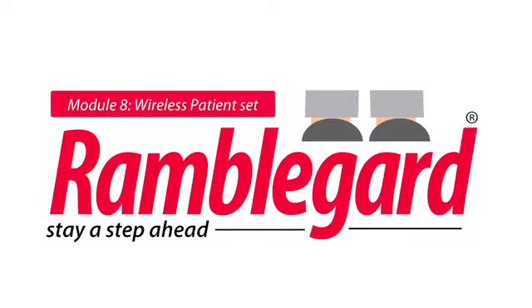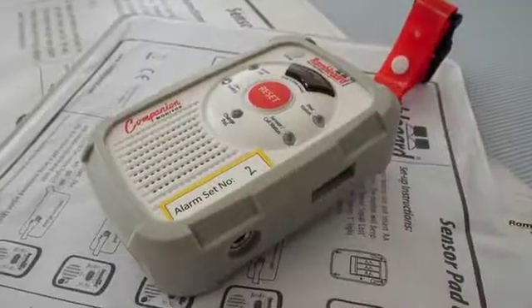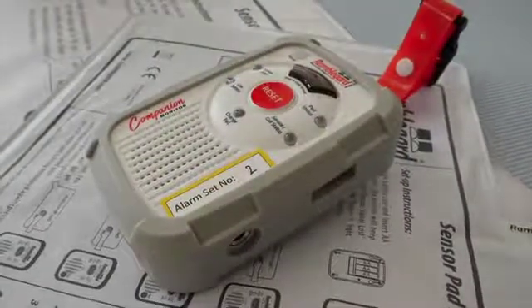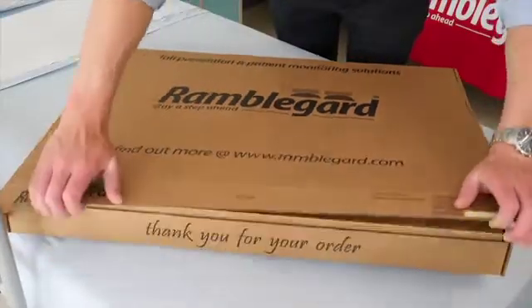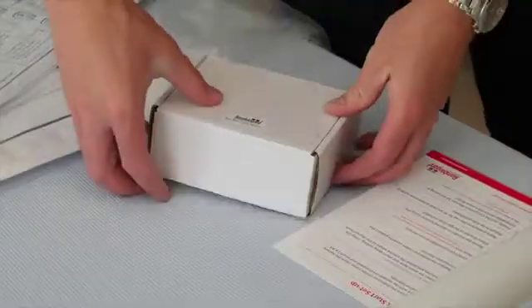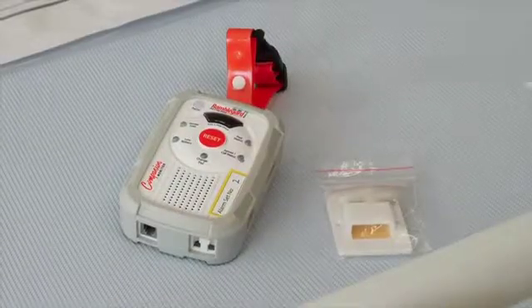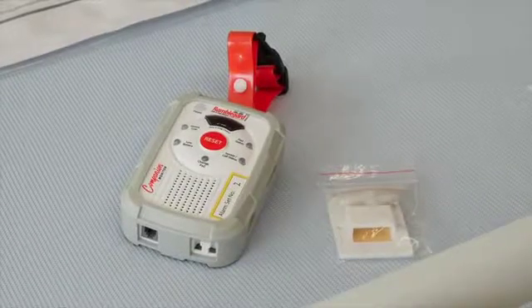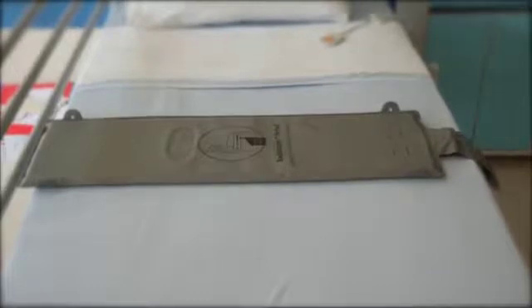Module 8: wireless patient set. To set up your Ramble Guard wireless patient set to work in conjunction with the wireless display panel and pager devices, first remove the components from the box and remove any packaging. You should have the following products now in front of you: a Ramble Guard wireless companion with reset and pause function, a wireless over-mattress or under-mattress bed pad with transmitter.